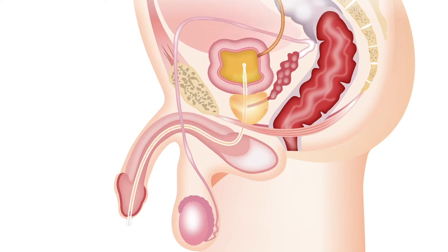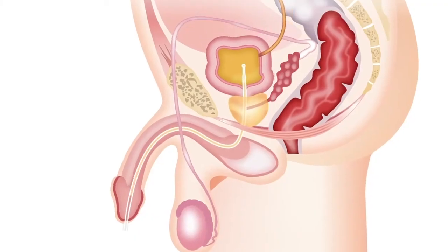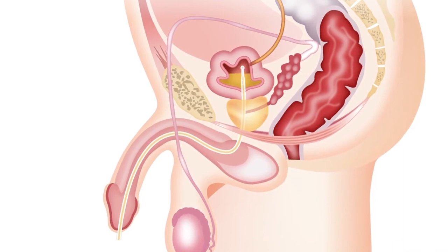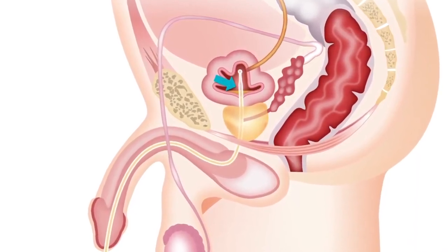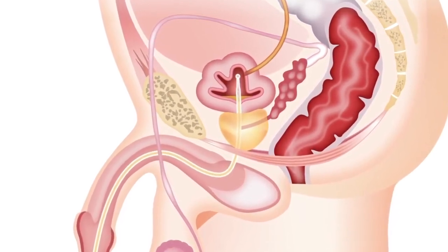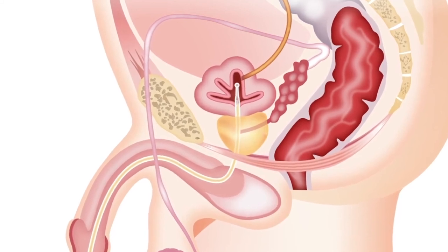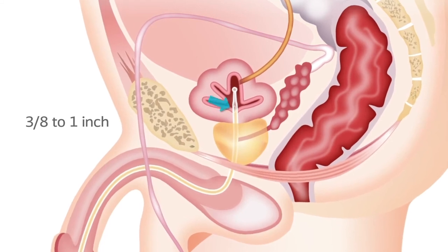When the urine starts to flow, place the hand not holding the handle on the bag connector. This is to ensure the catheter is not pulled out when more urine flows into the bag and it becomes heavier. Urine drains through the eyelets in the catheter. When the flow stops, it might mean that the urine level is below the level of the eyelets. To make sure that the bladder is completely empty, pull the catheter out about 1 to 2 centimeters to lower the position of the eyelets.